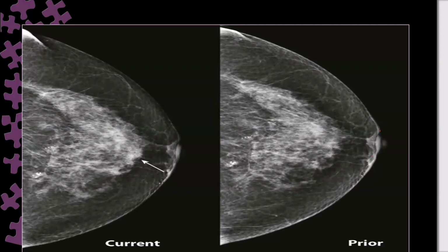No, can you read the corners of the image? Nothing is written in this image. You have to make use of anything. One image before the other, prior and current. Yes, you have to think about that. One image is prior, and the other one is current. So what does it show? The current compared to the previous.